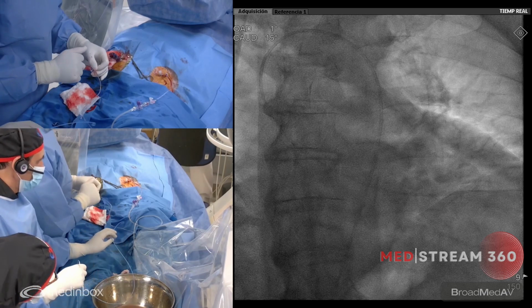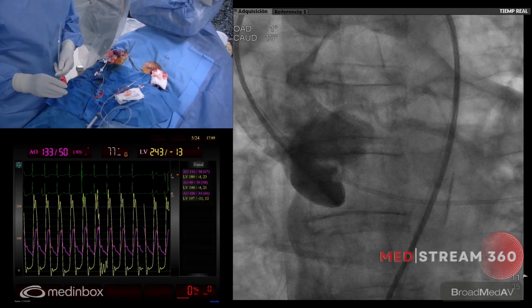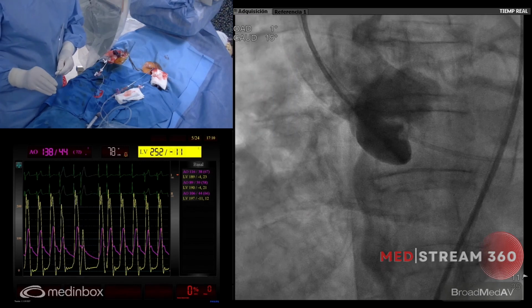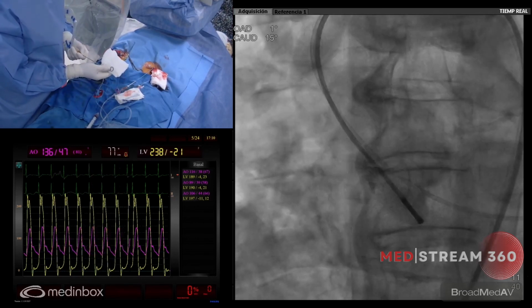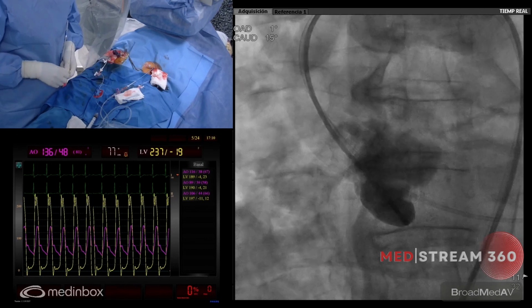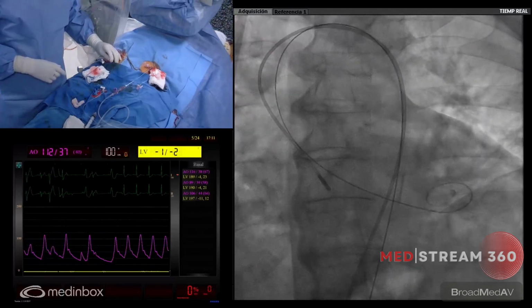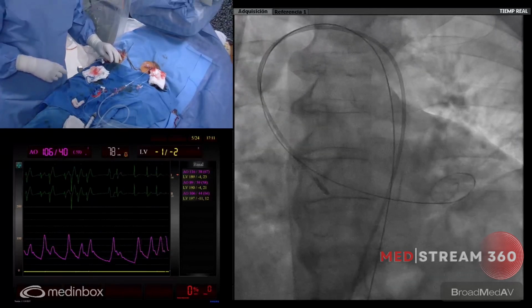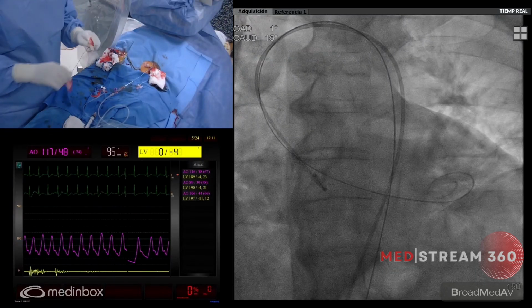So now we are going to position the contralateral pigtail. We have a configured wire here. As always, we try to reshape it, especially for small ventricles, to make it as small as I can. So here in the camera, you can see that we have downgraded. Now it's probably, this is my finger, 2 centimeters. And then one additional shape here, especially in this case for a very angulated aorta. We are going to pace from the wire. We will test during the predilatation. If we don't like it, we can introduce a pacing catheter into the right ventricle as usual.